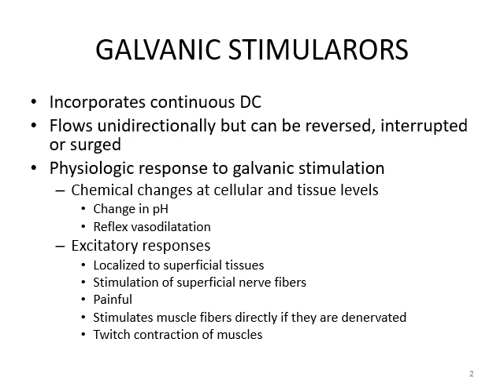The physiologic response to this type of stimulation can be classified into chemical response and excitatory response. As the current passes through the body tissues, there is an electron-ion interchange and chemical process which occurs, which results into alteration of pH, and that may also result into chemical irritation and reflex dilatation of the surrounding tissue, which may result into localized erythema.